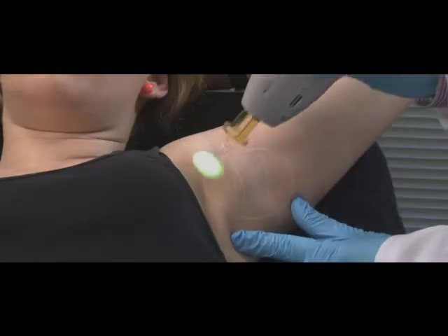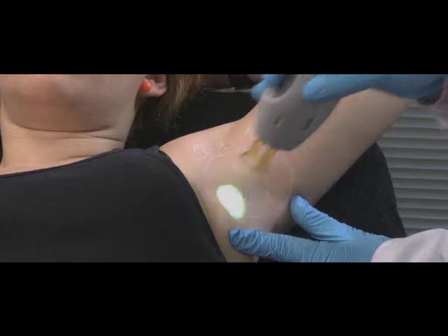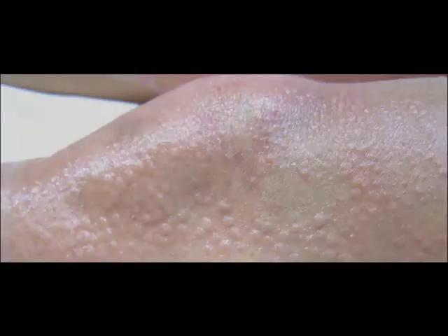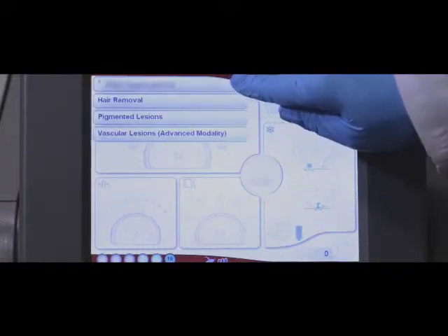Once the safety of the surroundings has been checked and the parameters have been selected, we will pulse the laser 1 or 2 times in each of the selected energies, and then wait for the skin's response. This is an example of a very strong perifollicular response. A milder variation is also acceptable. Now we can proceed to complete the treatment.